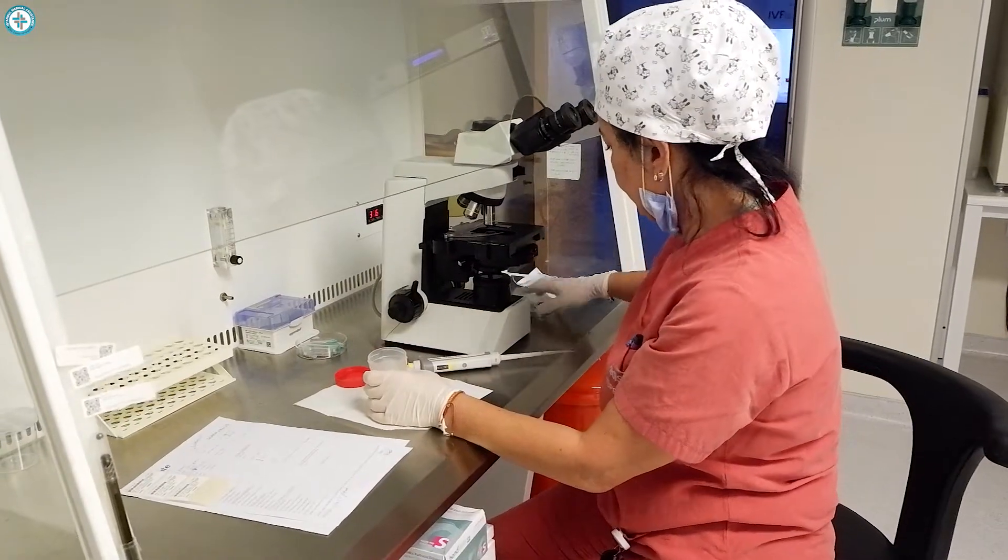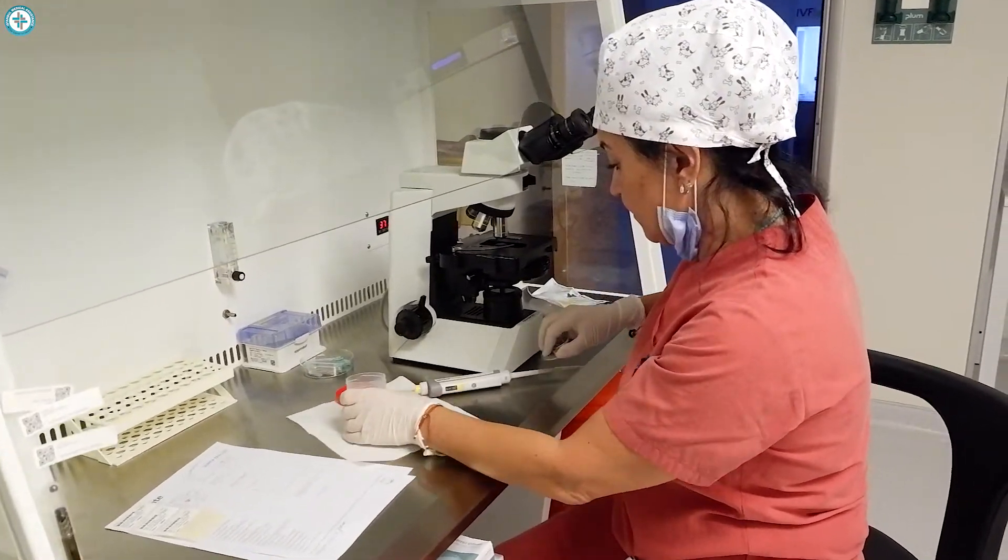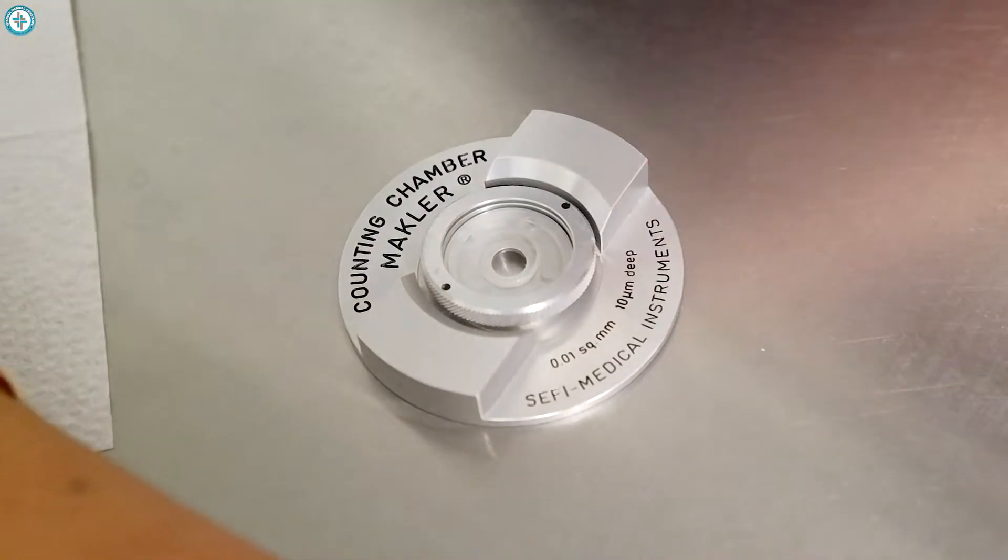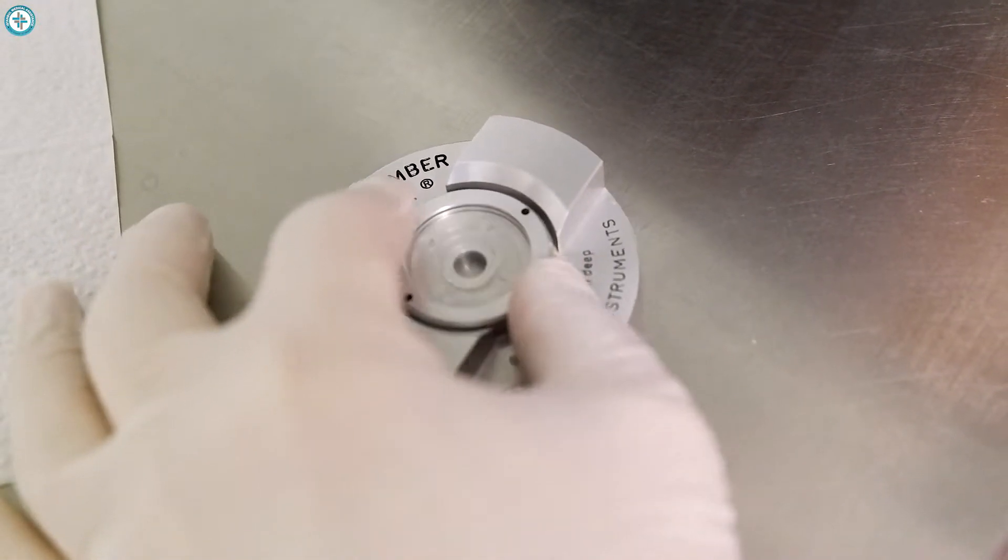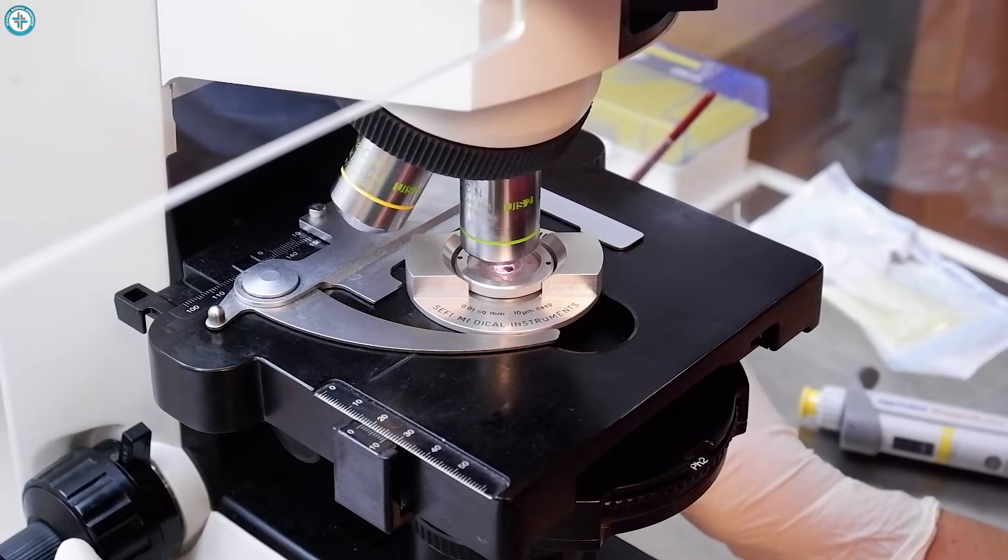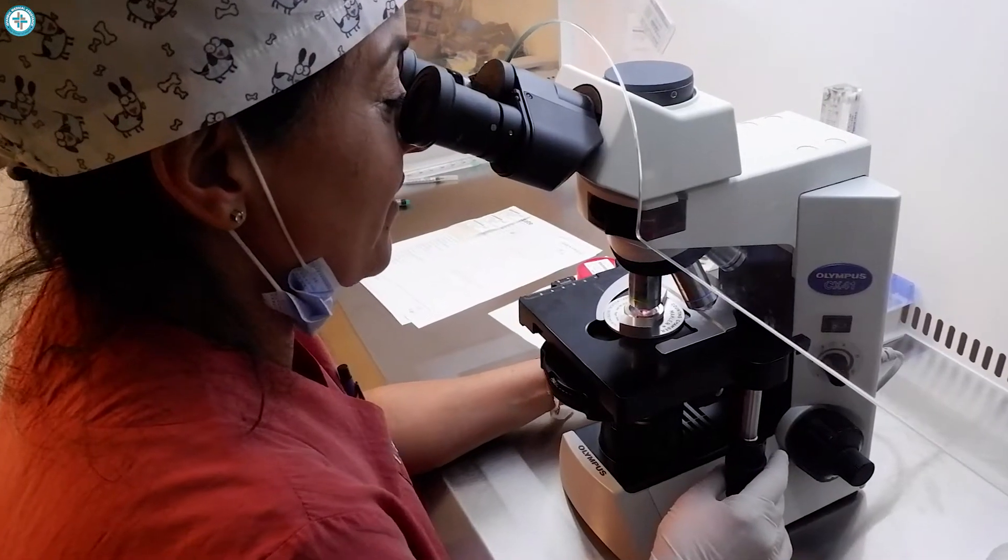For counting sperm, she puts the sperm in a Makler sperm counting chamber, which is an easy to use device for the fast, accurate sperm count. She performs the analysis directly on non-diluted semen fluid by a microscope.